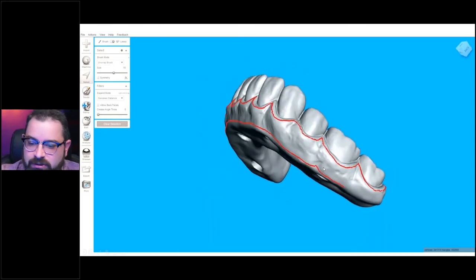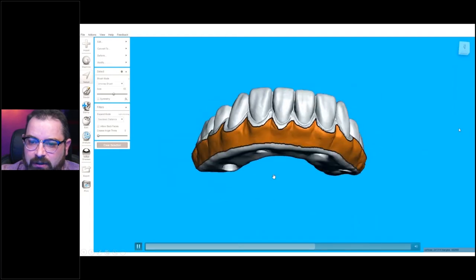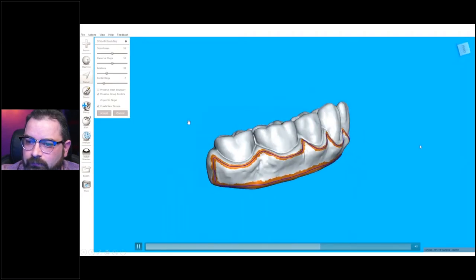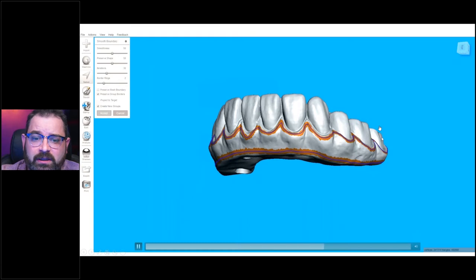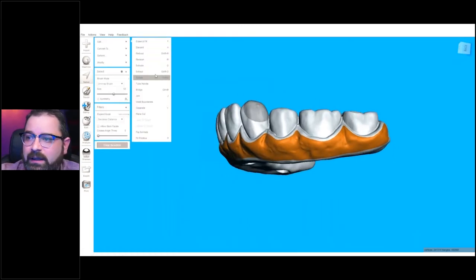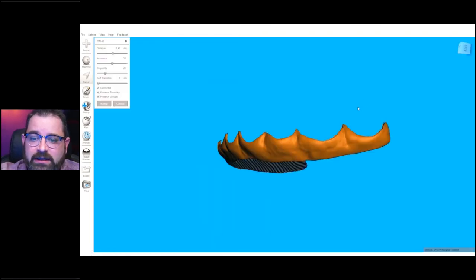So you simply go all the way through and then select the area that you need to. Once you've done that, you go into the edit mode. Here I'm smoothing the boundary — if you press O and then B on your keyboard consecutively, you'll smooth out the boundary. And then here I went into the offset mode, actually offsetting the area that I want to add composite to.